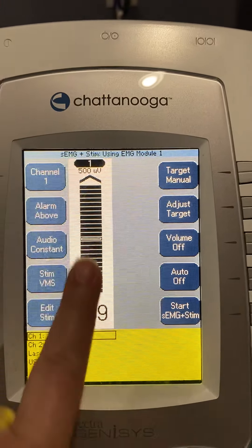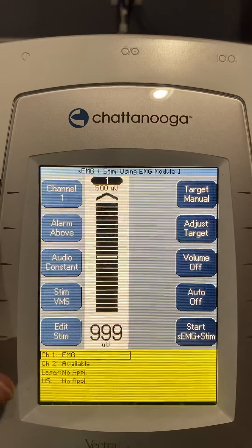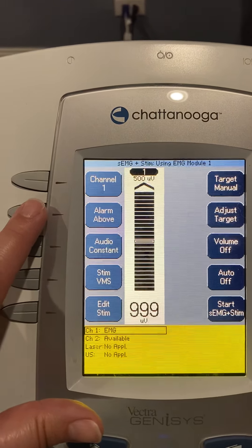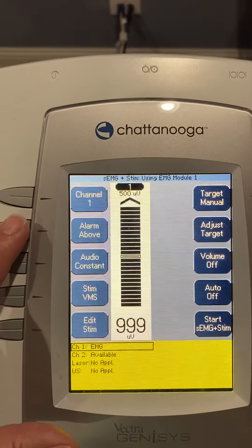With just one channel plugged in, you can see we have a readout for one channel. We can choose to have the alarm sound only if the patient goes above their threshold. What we're going to do first is to strengthen somebody.